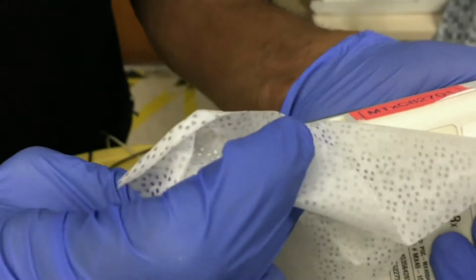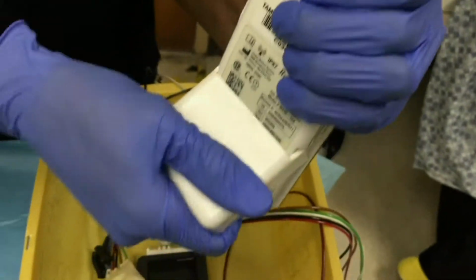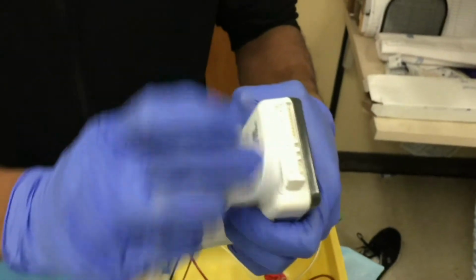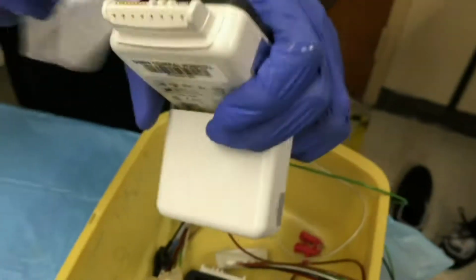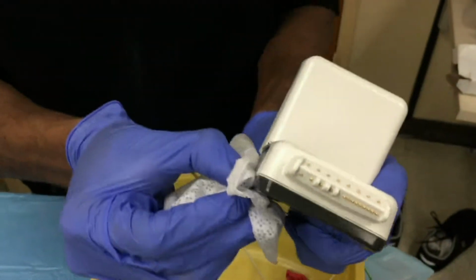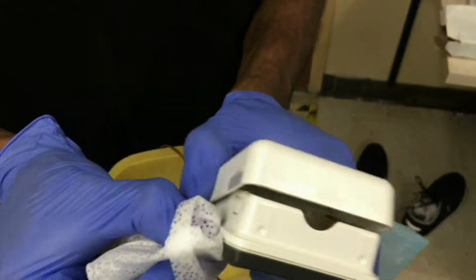You also want to clean along the outer perimeter of the battery dock and then place the cover back on. Additionally, you want to ensure that you clean along the top of the monitor. You can then use the wipe to clean the outer perimeter of the monitor and within the crevices. Pay close attention to these edges, as they often hold debris.